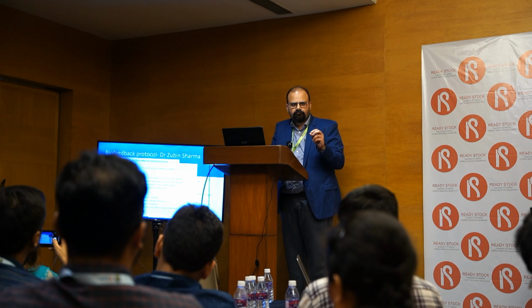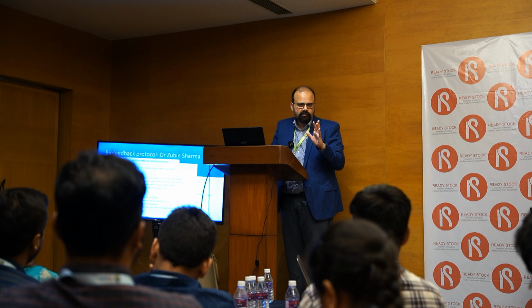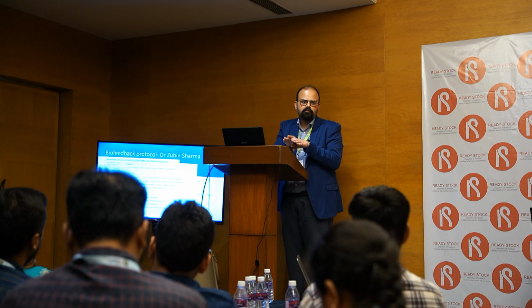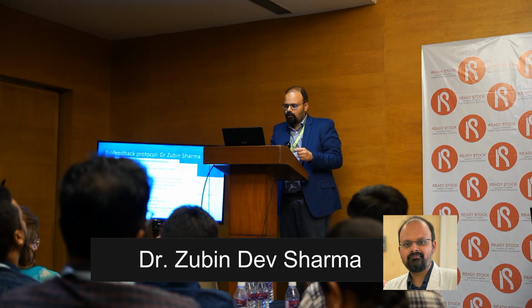Usually by session 3 or 4 I add the simulated defecation, as I said. Once they have mastered those first 2 steps, I ask them to combine them together. You relax and you push, you relax and you push. So that's when they start doing that.